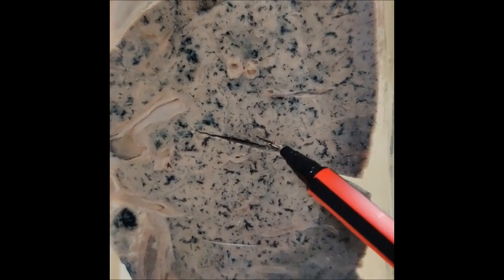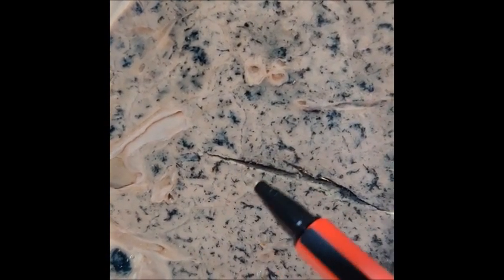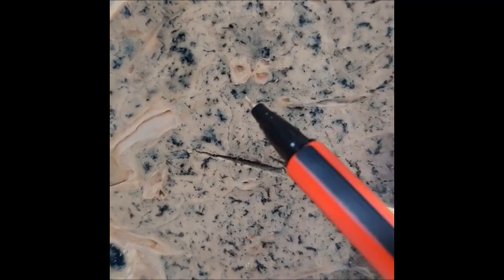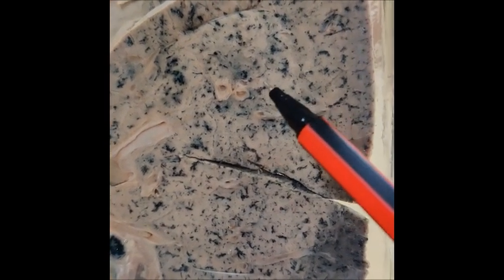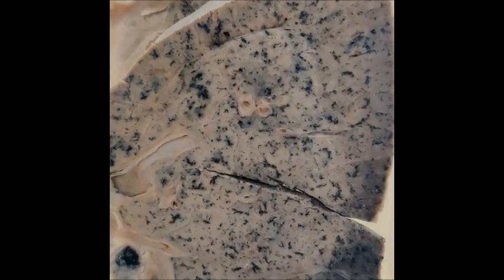Yes. So this is Grey Hepatization. Okay. So it has involved, this is lobar pneumonia with Grey Hepatization. It involved the entire lobe and then major portion of this lobe. So well we can appreciate this. So once there is a pathology here, all the carbon pigment looks displaced. That means there's some pathology in between which is making the carbon pigment appear less compared to this. So this is a specimen of lobar pneumonia in Grey Hepatization.